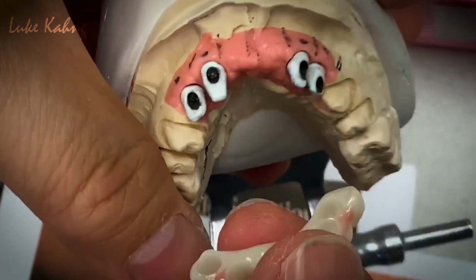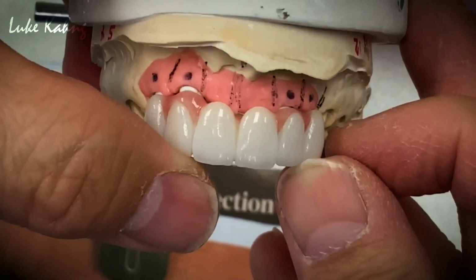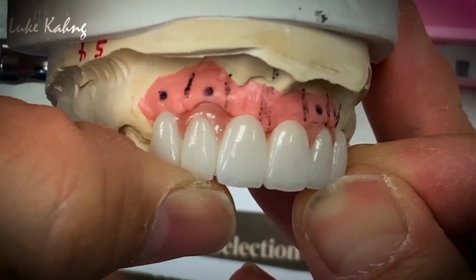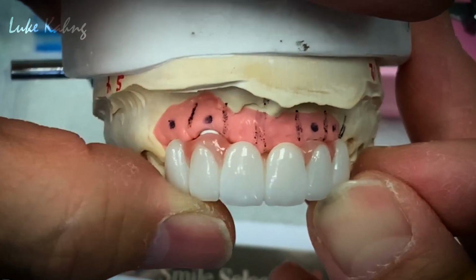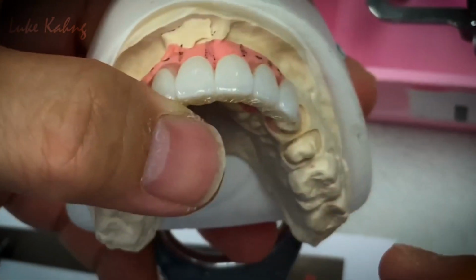And also, this is the final. The zirconia with the pink aesthetics like this. They will really like it here. Here's the final. Make sense? Alright, this is it. They have to push it a little. Great translucency, great symmetry. We're trying to pre-plan it so they can get it.